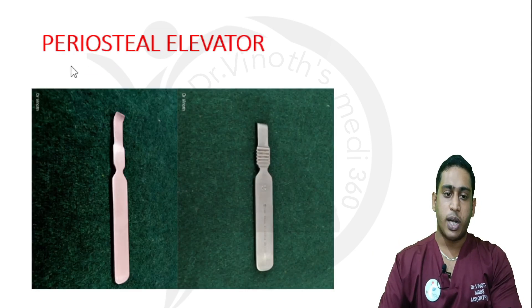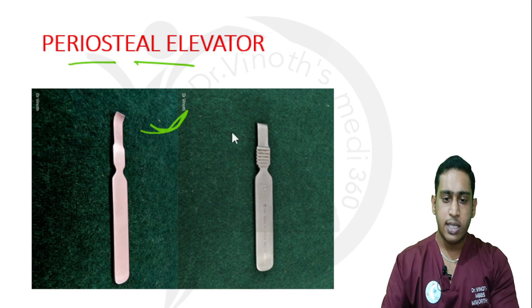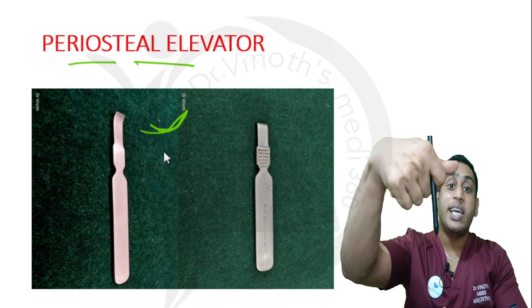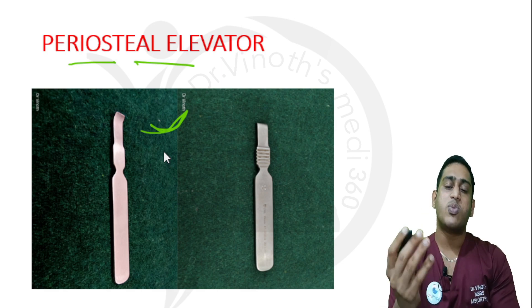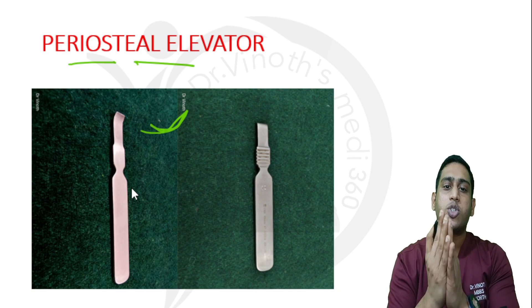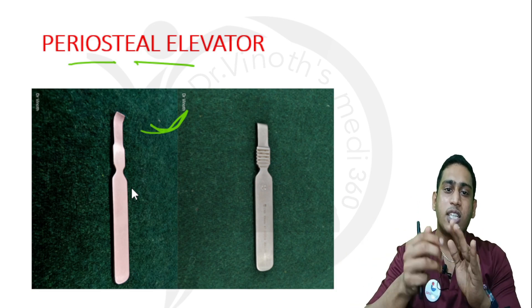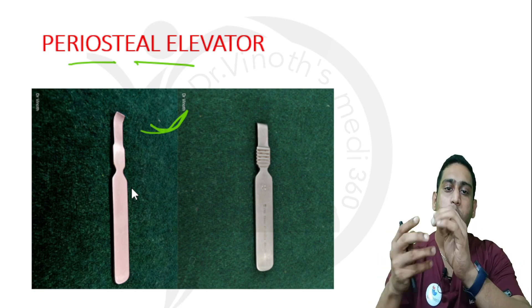The next instrument is the periosteal elevator. On the posterior surface it is curved, and on the anterior surface there are multiple serrations to hold it with the thumb. I hold it like this and elevate the periosteum. We need to elevate the periosteum because 20% of the blood supply to the bone comes from the periosteum, so we should ensure minimal damage to it. The periosteal elevator is also used to raise a subcutaneous flap above the bone.